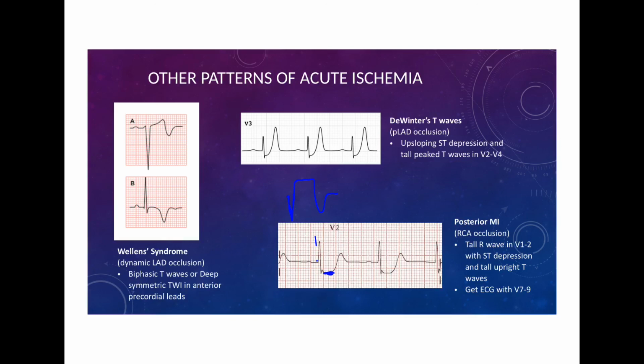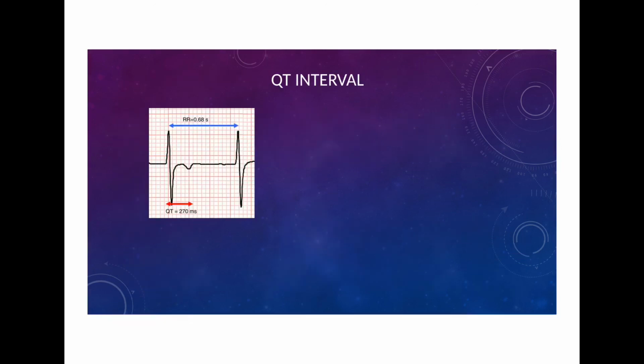If you ever saw this and you wanted to confirm for sure, you can get a posterior-sided ECG with leads V7, 8, and 9, and you'll see ST elevations in those leads.